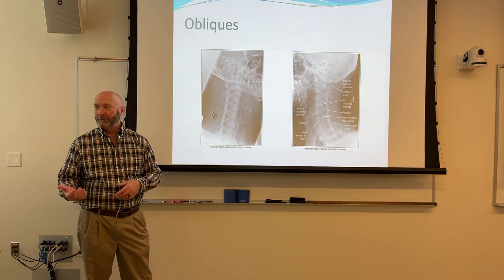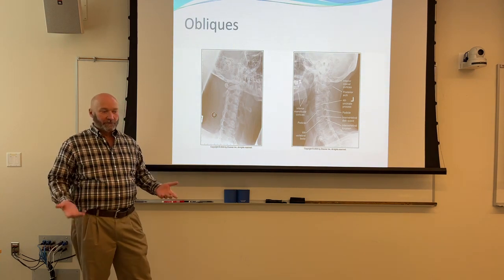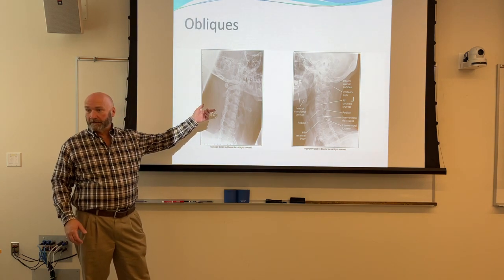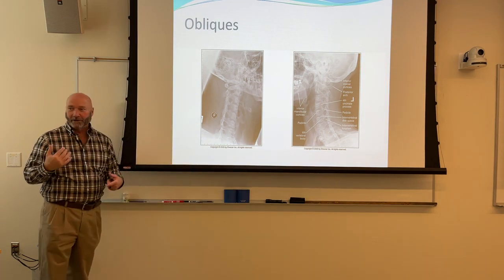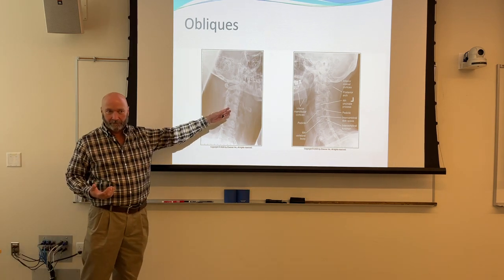That's one possible, just muscle them up, right? But the problem is you start rolling them up like that, and they're going to have a tendency, you've got to get to 45 degrees. Bump, right? Now they're on the floor. Not a good look. So what do you have to have for a good oblique?